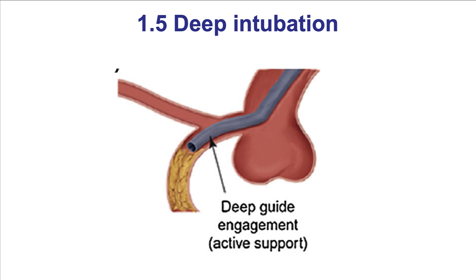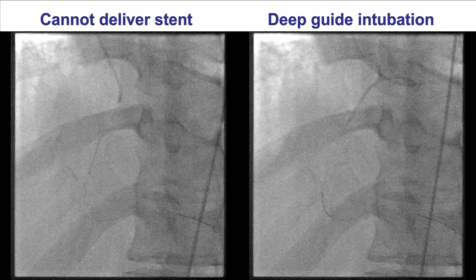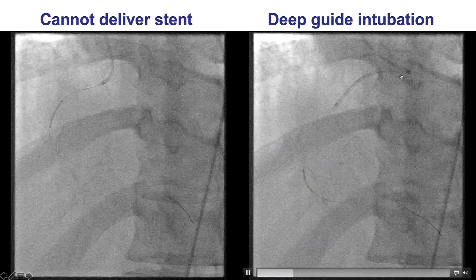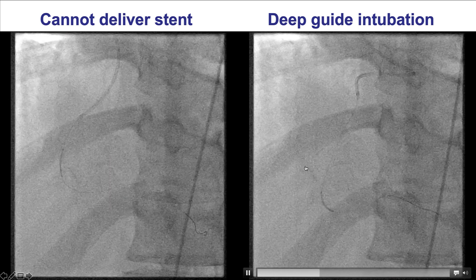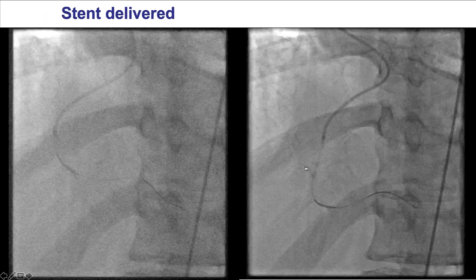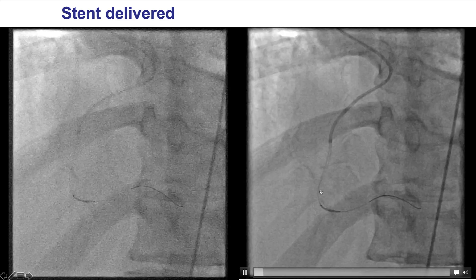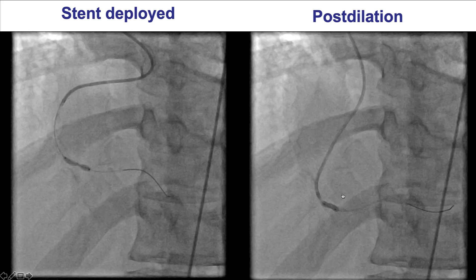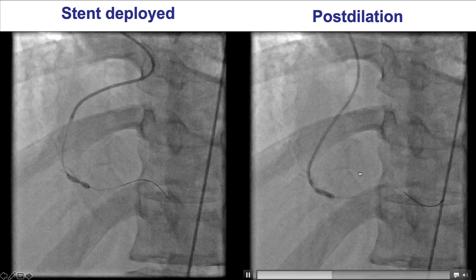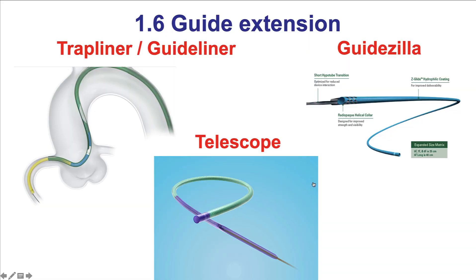The fifth way is to deeply intubate the guide catheter. This is an example of difficulty delivering in the right coronary artery with clockwise rotation. We see the guide is actually being deeply intubated into the right coronary artery — eventually almost all the way down to the lesion. That facilitated delivery of balloons and stents with a nice final result, both before and after. The guide is essentially all the way down to the distal right coronary artery.